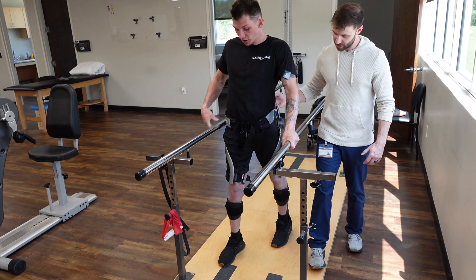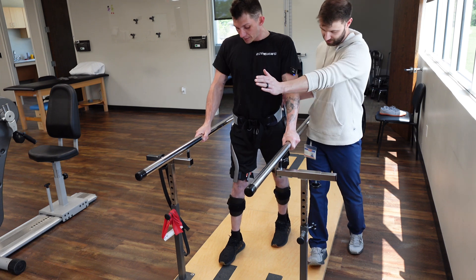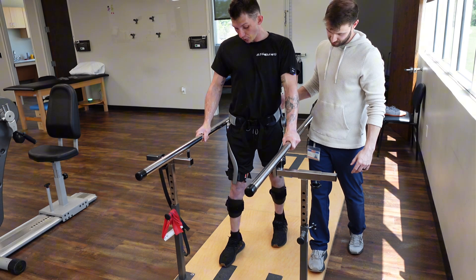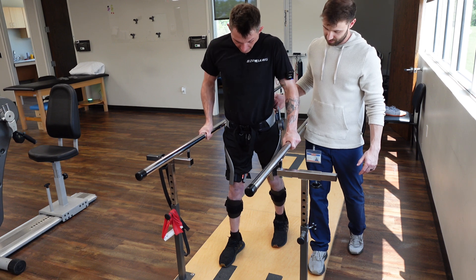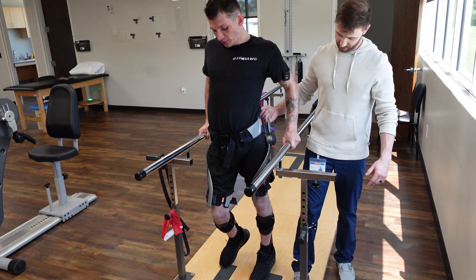That's the money. So where's your target whenever you're leaning? I'm thinking glute all through my heel. Lean forward and pull that left knee to my chest.